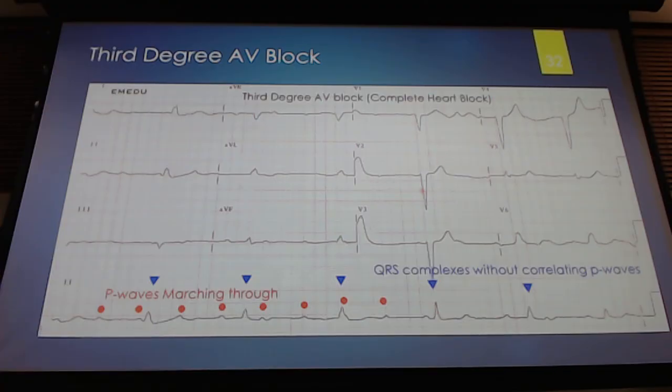Up here we can definitely see QRS complexes. We see QRS complexes all over here. So that's associated with these in lead 2. This would be a time, if you had the capability, to put all your leads down as your 10-second strip. You could put lead V1 down there, and V2 down there, so you can see, look, I can definitely see my QRS complexes more prominent in V1, V2 than I can in lead 2. So on some ECG machines you can just change the bottom lead to a different lead, like V1, V2, something like that. But these are our QRS complexes. Here, then here, here, and here.